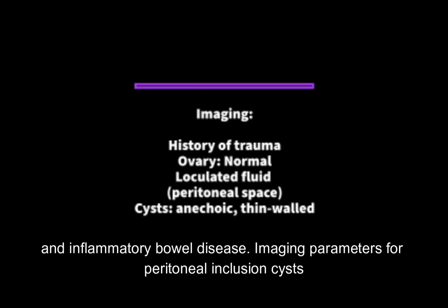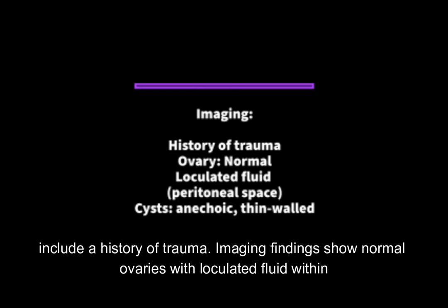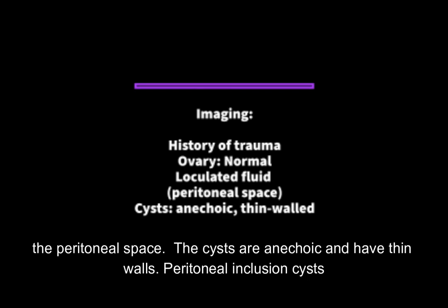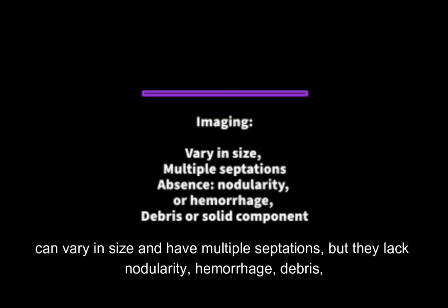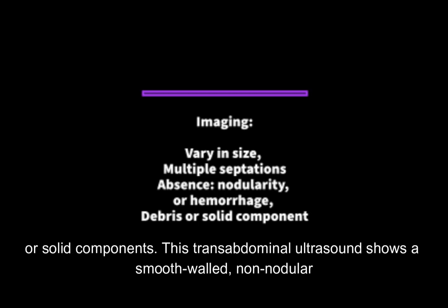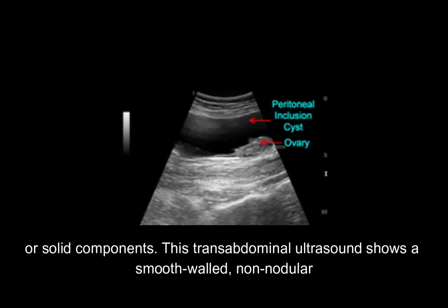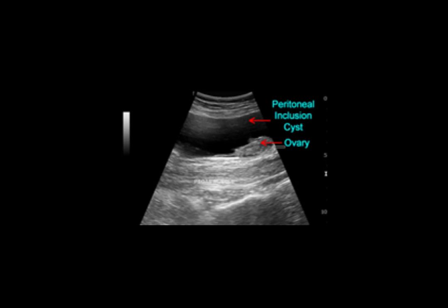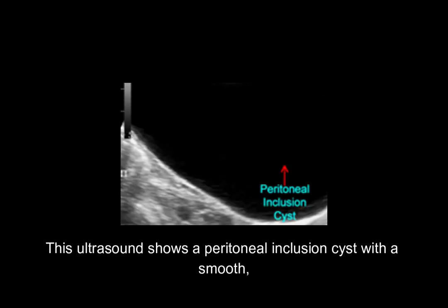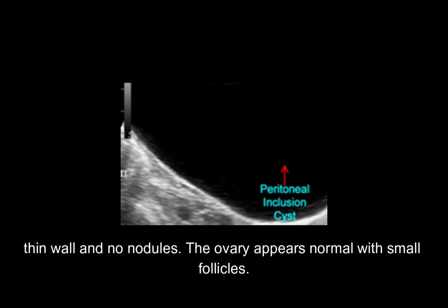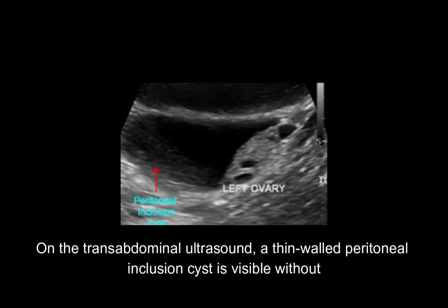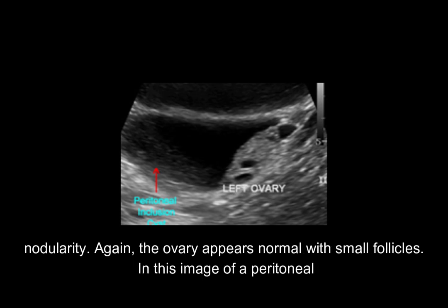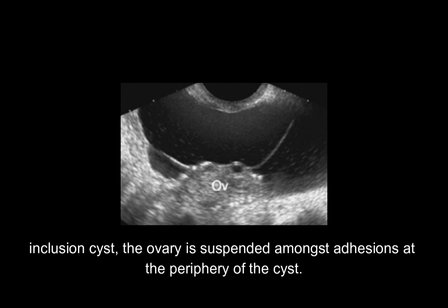Imaging parameters for peritoneal inclusion cysts include a history of trauma. Imaging findings show normal ovaries with loculated fluid within the peritoneal space. The cysts are anechoic and have thin walls. They can vary in size and have multiple septations, but lack nodularity, hemorrhage, debris, or solid components. This transabdominal ultrasound shows a smooth-walled, non-nodular peritoneal inclusion cyst with the ovary appearing normal with small follicles near the psoas muscle. Additional images confirm thin walls, no nodules, and normal ovaries. In one image, the ovary is suspended amongst adhesions at the periphery of the cyst.